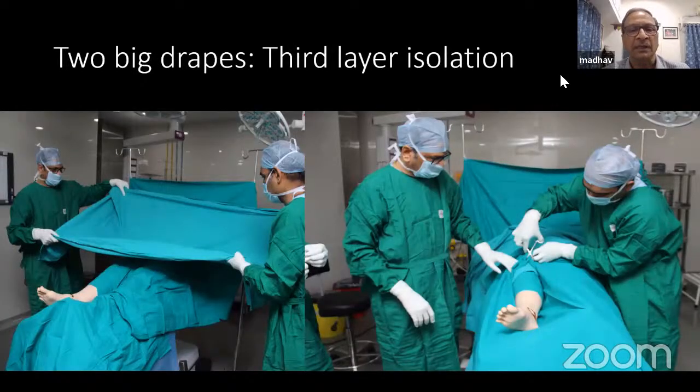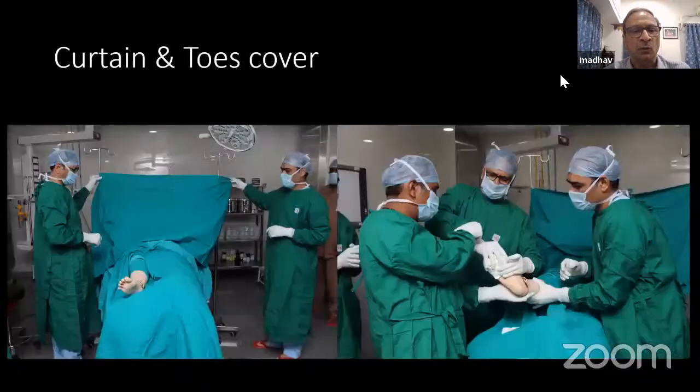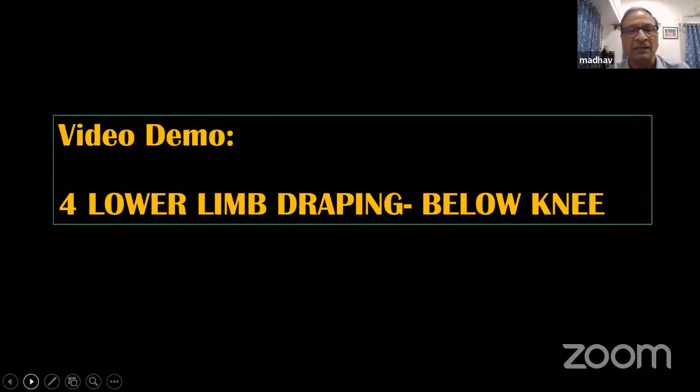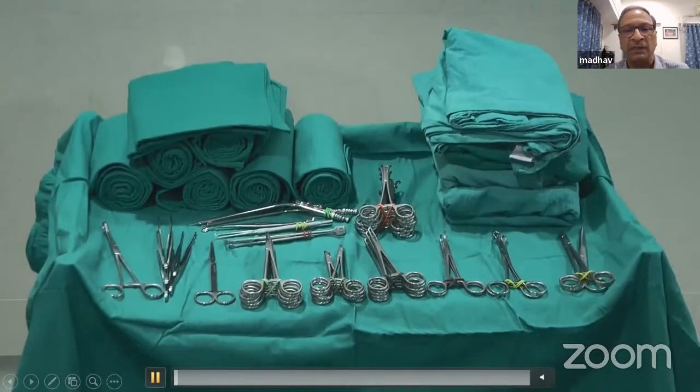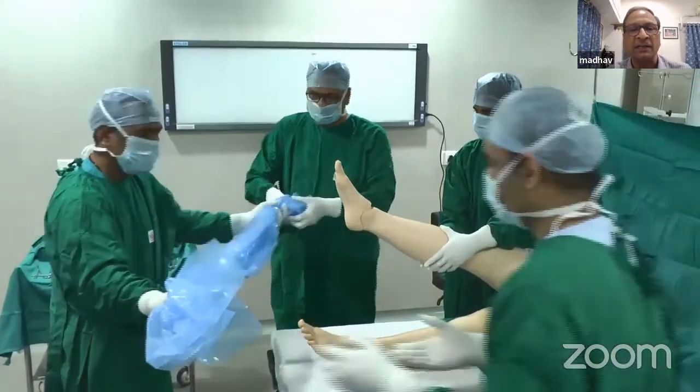The limb is scrubbed and prepared properly by one of the assistants, an assistant who has washed up and gloved, who holds the limb. Here you have to be careful that you prepare the entire leg, that is the entire foot and the web spaces between the digits, because you need to clean the foot completely. So this is a trolley which has been laid. Now we will start the draping.